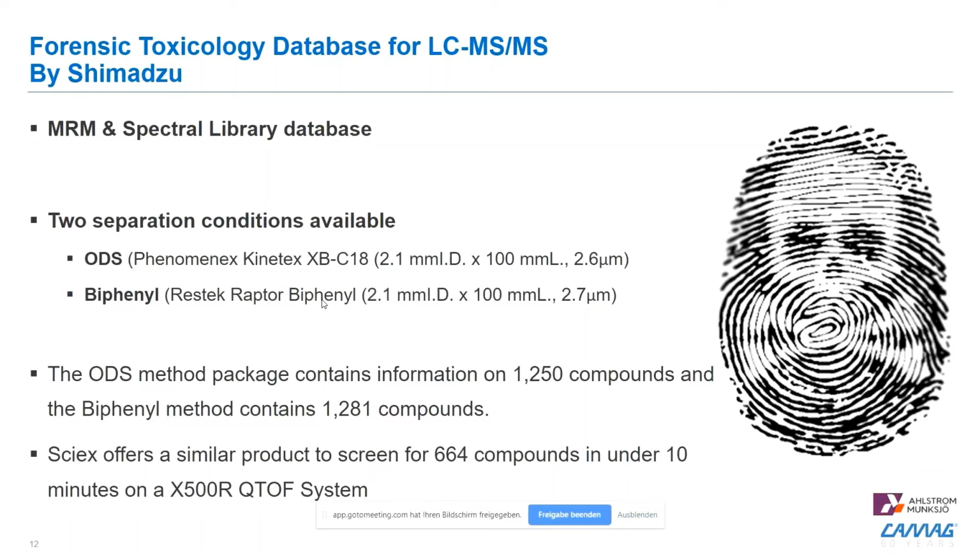For the one from Shimadzu, there are 2 separation conditions available, one with a C18 ODS Kinetex column, or one with a Restek Raptor biphenyl column.